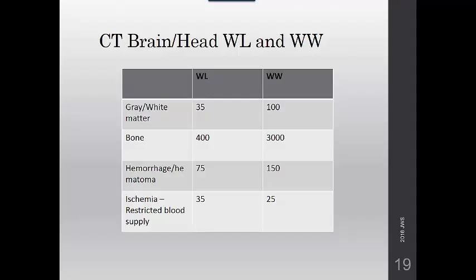All body tissue, including fluid, air contained within the body, and the tissue itself, fall within this range of numbers relating to their attenuation characteristics. So pertaining to images on the scanner, the window width controls the contrast and the window level controls the brightness that our eyes perceive on the monitor as we're looking at the images.